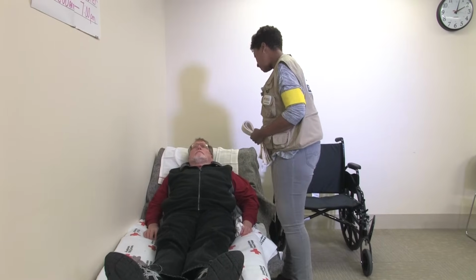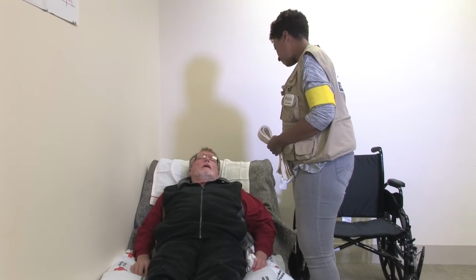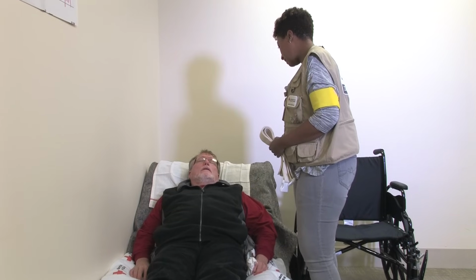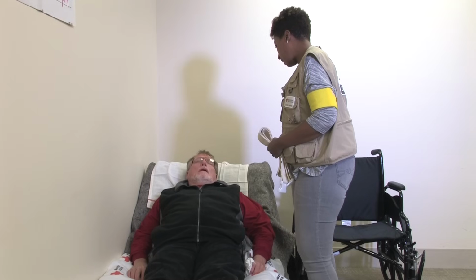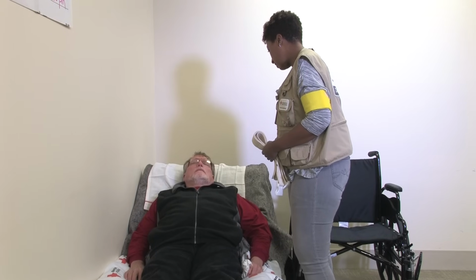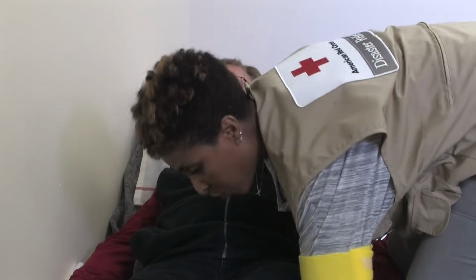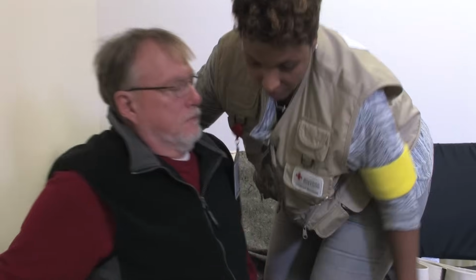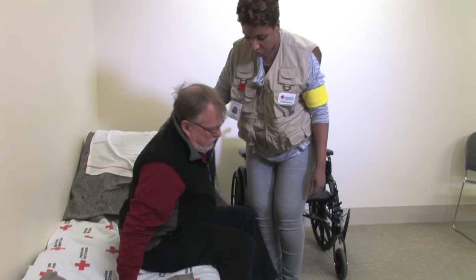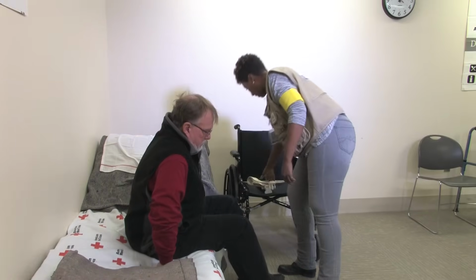Hi, Mr. Stevens. I'm Keisha. Do you remember me? We met yesterday? Yes. Hi, Keisha. It's dinner time. I'm here to take you to dinner, so I'm going to help you get into your wheelchair. Is that okay? Yes, that's okay. Okay. So I'm going to put my hand behind your back to support you as we swivel around. Okay. And I need you to scooch to the end of the bed as much as you can. There, how's that? Okay.